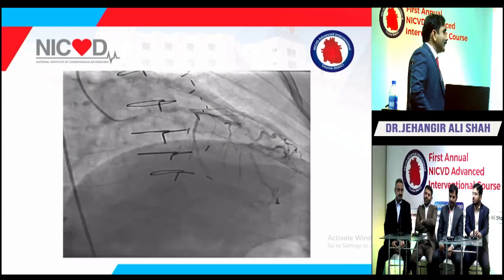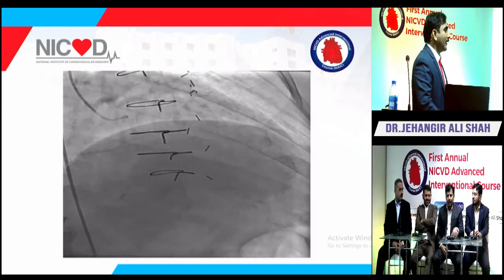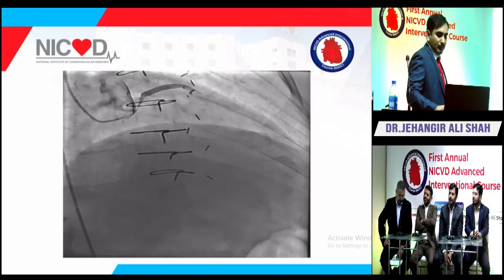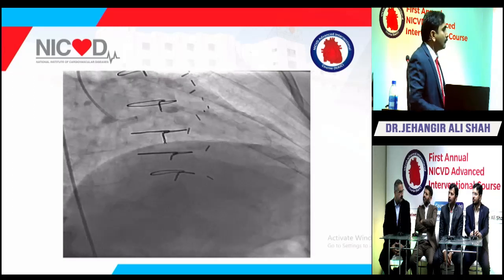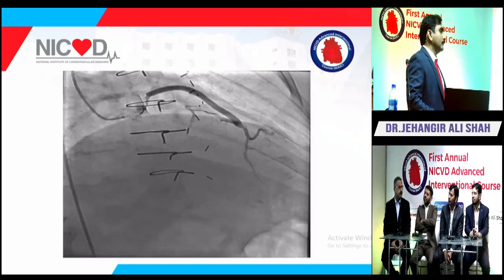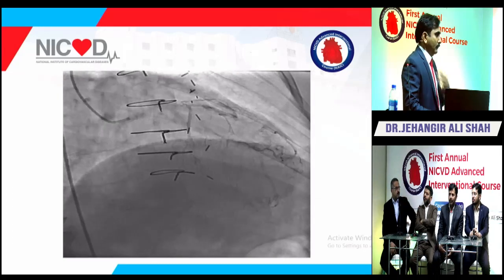So my question to the panelists: if you see this patient in your clinical practice, how will you approach it? Okay, we can comment about this case. This patient is a 70-year-old male, probably diabetic and hypertensive, who received these grafts about 18 years back. He has 2 SVG grafts totally occluded and one that is also degenerative. Angiographically it looks like 90 to 95% aorto-ostial disease. For discussion, one can say that we will discuss this case in the heart team, and the heart team will advise.